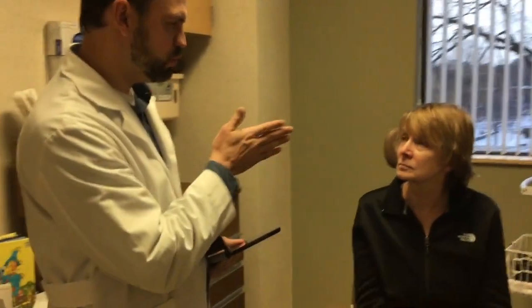But okay. So this part of my nostril is now going to be freer, right? Yeah. This is where the problem was, on the right side. The septum was more to that side, so you'll be able to breathe better on that side because of the septum. Yes. And also the turbinate, we moved that over as well.